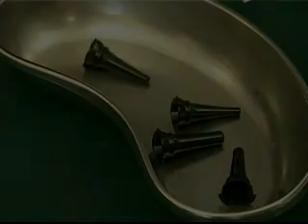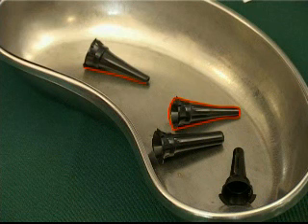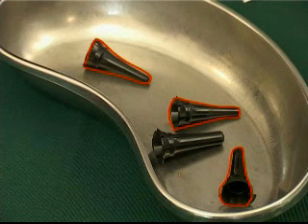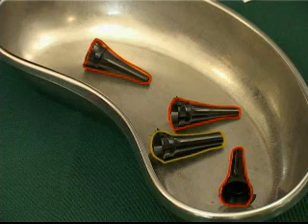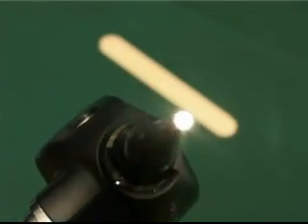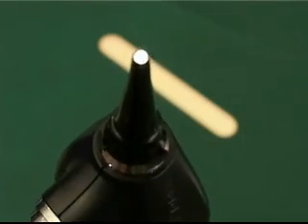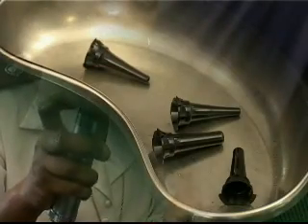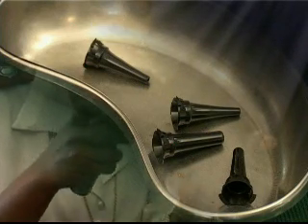The otoscope is supplied with a set of plastic specula in various sizes, generally 2 mm, 3 mm and 4 mm in diameter, used for aural examinations, and a 5 mm speculum used for nasal examinations. The smaller size speculum can be used for nasal examinations in infants and children. Most suppliers offer a range of disposable specula, which can be purchased separately.